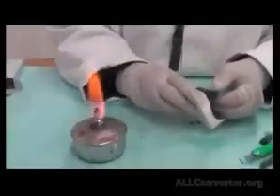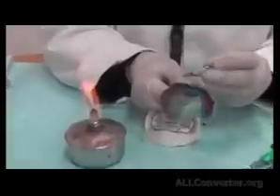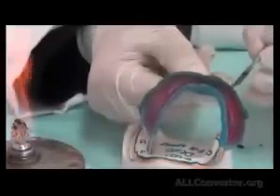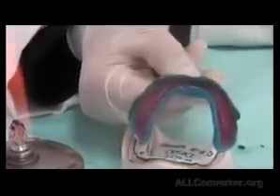Now I want to show you what might happen sometimes while you're border molding. If you could look closely there, you find that this area did record the sulcus well, while this area is still deficient and irregular, and the shining of the material that we have produced by the flame is still there. This means that the green stick did not touch the sulcus area.